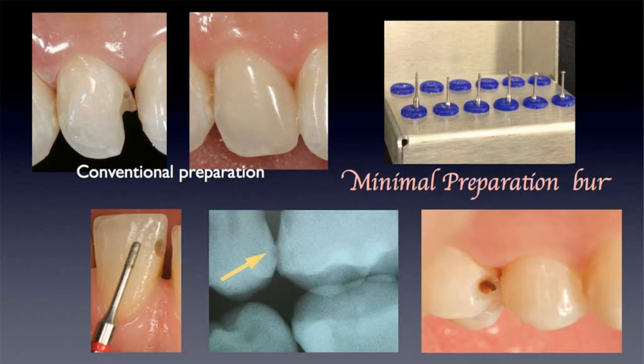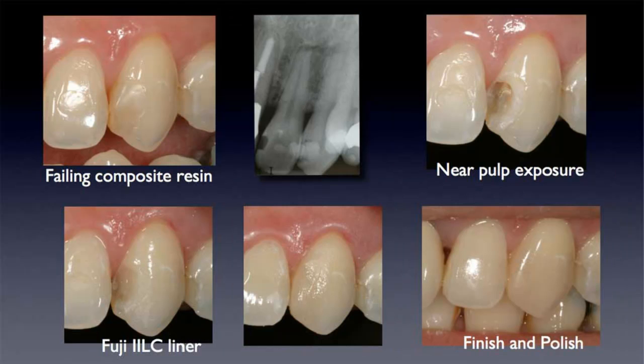And this is what it looks like radiographically. The radiopacity is really critical because, as I mentioned before, if you have too harsh of a radiopaque marker in the composite, it starts to lose that chameleon effect, and so we need to be very careful about that. And so this is quite a nice balance, I find, with this material. And so let's go over this step by step on the class 4.